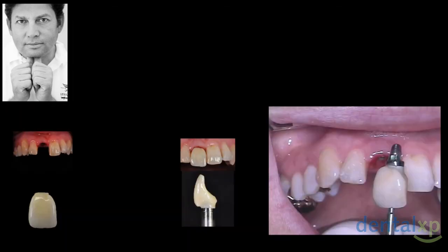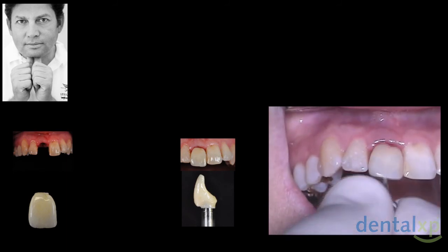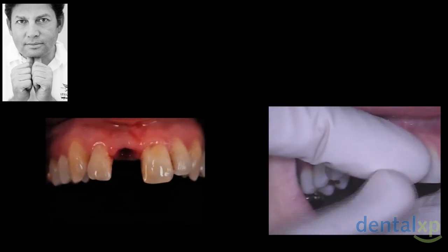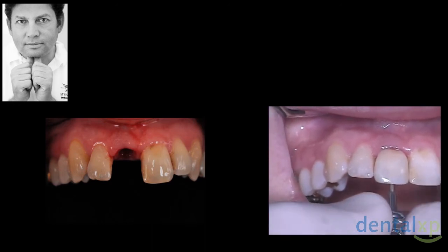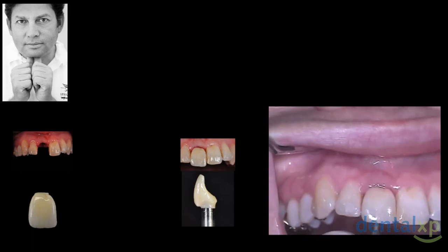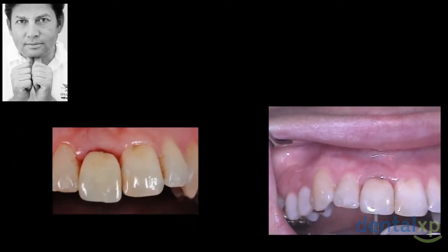And then we looked at the follow-up, and you see when we place it in, of course, this is going to shape the zenith, the compression. We're going to have a concavity outside. And from around, with subtraction, when we don't have enough soft tissue and we have additive methods, then it's totally different. So this is what we're doing today prosthetically, analog or digitally. And both of them are limited. So you can see now, this is what's going to happen.